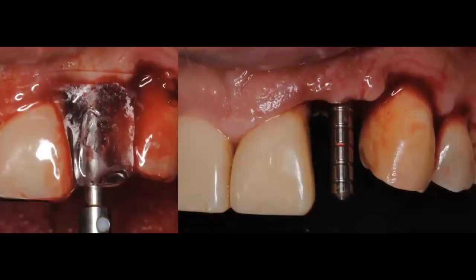So what I normally do is that for this clear matrix, I'm going to create an access hole on the lingual that is approximately 2 millimeters in diameter. So with that access on the lingual, that is what I'm going to be using for my pilot drill. What you see on the left-hand side is me with the clear matrix in my patient's mouth, and I'm using my pilot drill to go in and access that site through the lingual of my clear matrix.